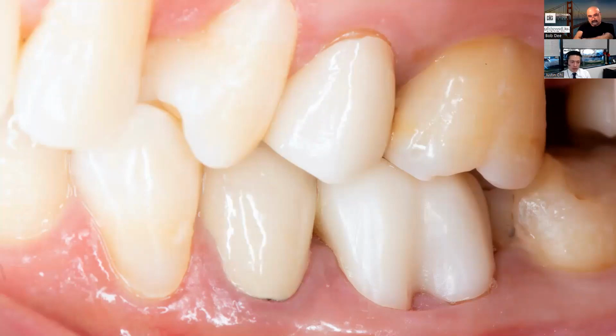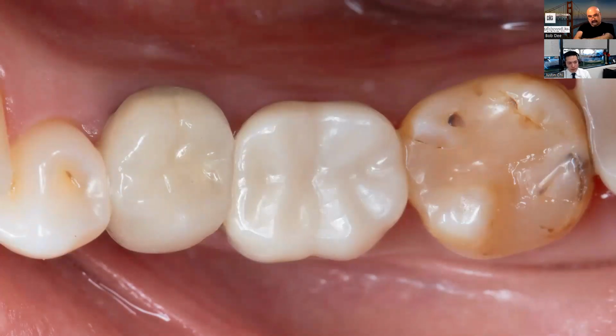Let's take a look at the occlusal. And this is just with a light polish. I mentioned there is a Bruxer polishing kit that you can use. And there's really just that one polisher that I like using from that kit. There's a brown and blue polishing wheel. That brown polishing wheel does a nice job of getting a nice light polish on there.